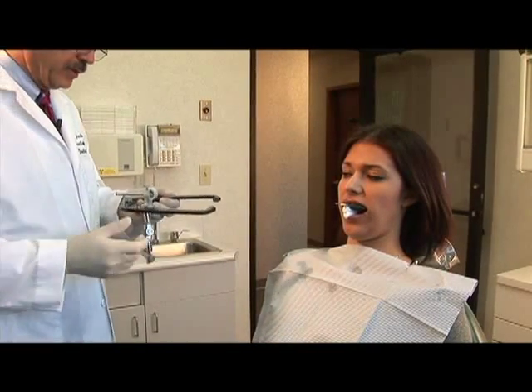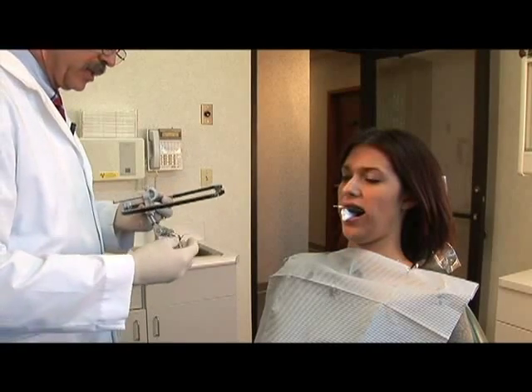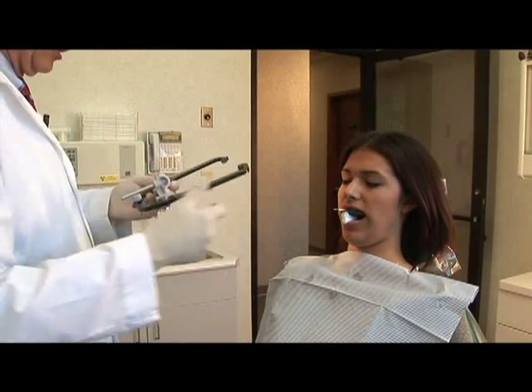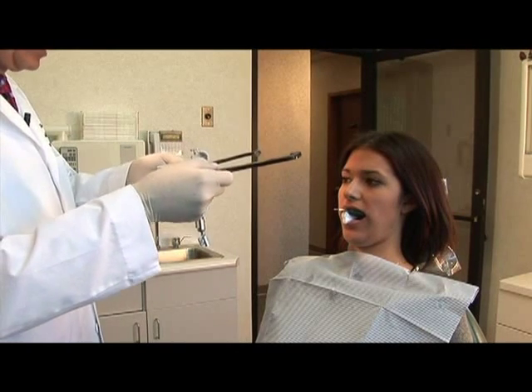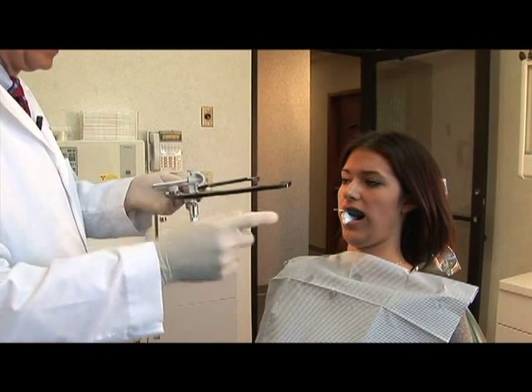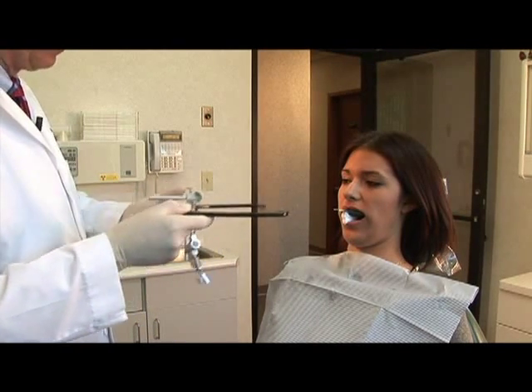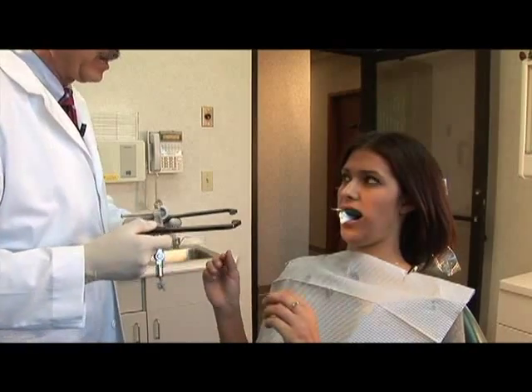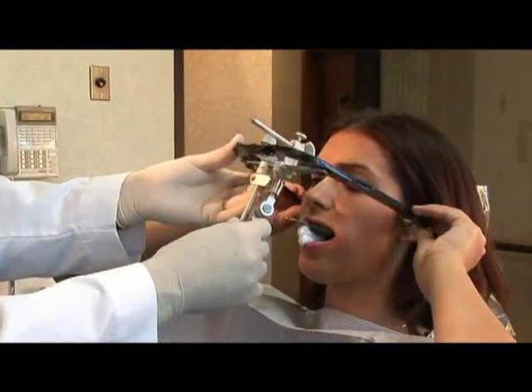All right, the way this is going to work, I want you to keep your head right in the headrest. I'm going to slip this on the piece right here and tighten it. But before I do that, I'm going to have you place these in your ears, and put one finger on either side, just like this for me. Why don't you go ahead and brush your hair back behind your ears there for us. Go ahead and place those in your ears.